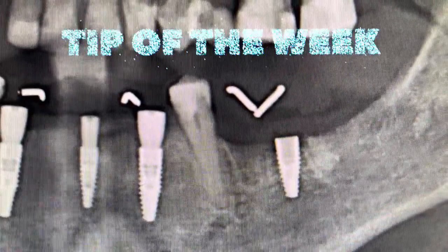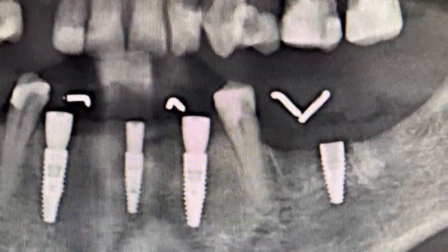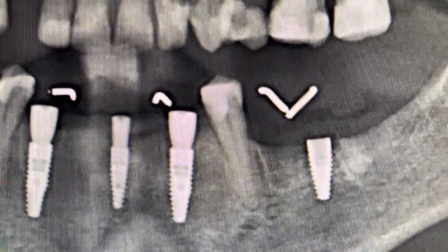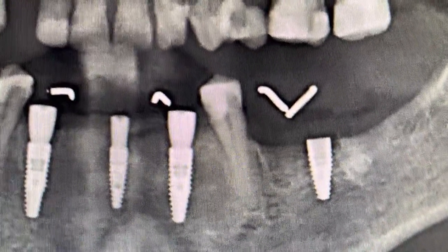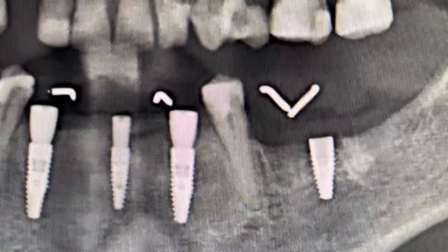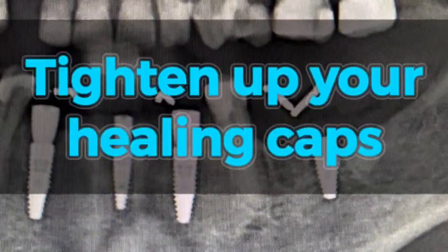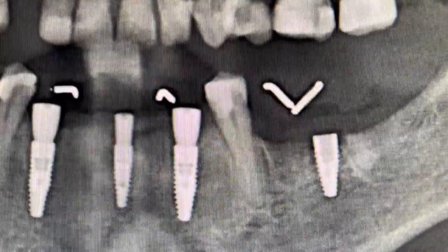So one of the tips of the week is that particularly when you're seeing patients that have potential to be away for a long time between surgery and the prosthetic phase, it's a good idea to make sure that when you're installing your healing abutments or healing caps, you torque them down so they're pretty tight.